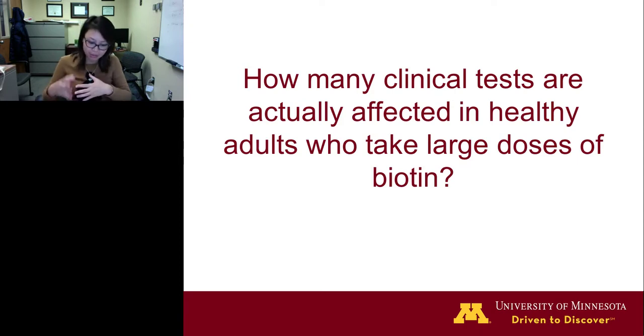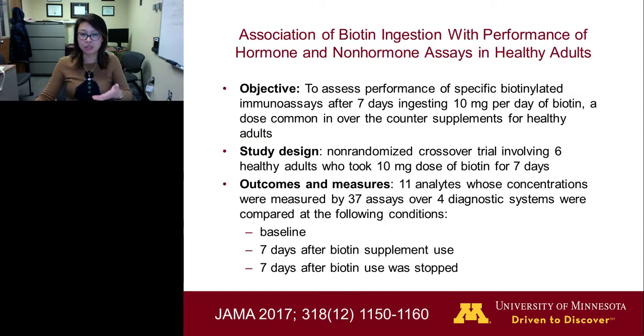I want to take a step back and just think about this question. We talked about how there are many clinical tests that utilize biotin and streptavidin, right? We also know it's possible that not all the tests that utilize biotin and streptavidin would be affected, and the impact may depend on many different factors. So this study is really designed to answer the question: when an individual takes a large dose of biotin, how many tests are actually affected by the amount of biotin present in the blood.